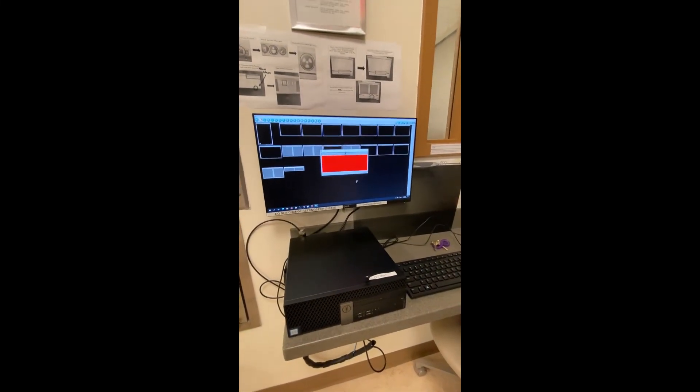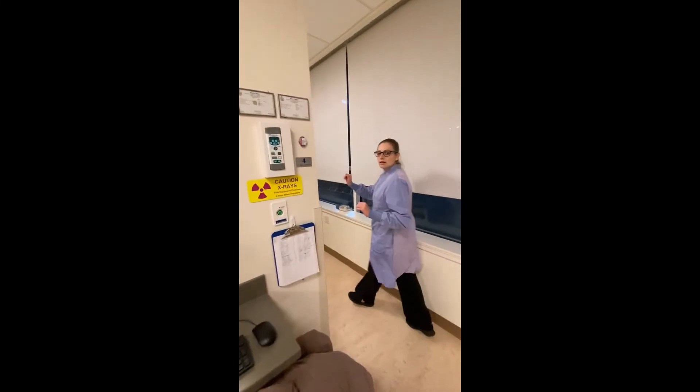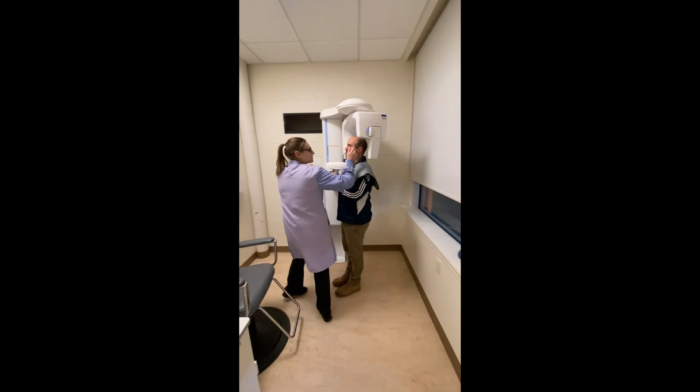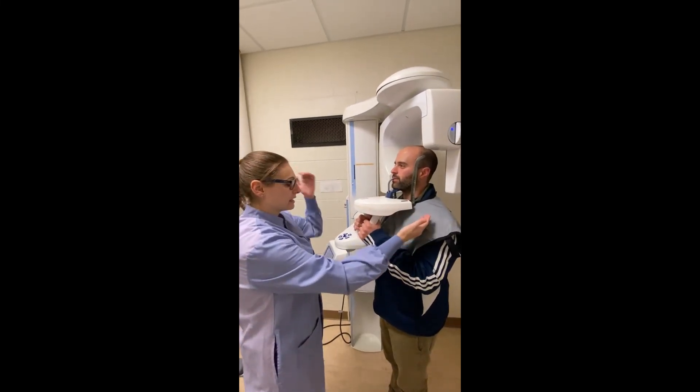Once you press okay, the panorex is going to upload into the patient chart. The temporal headrests will automatically open and you're going to ask the patient to please step back.